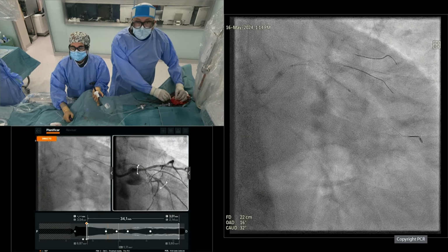What is the final size? What is the size you chose? It's a 3.33. I suspect it's a stent whose name starts with an X. Exactly. You can imagine it's a science. Go for it. So no knuckles in the wires.